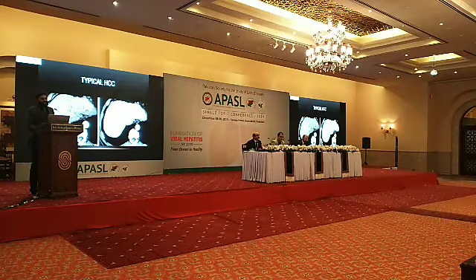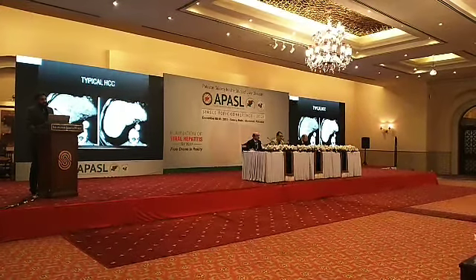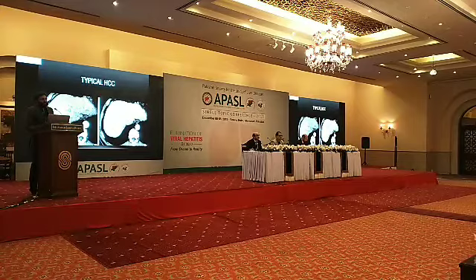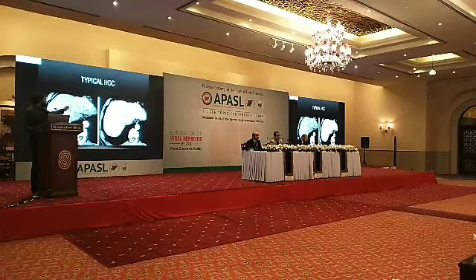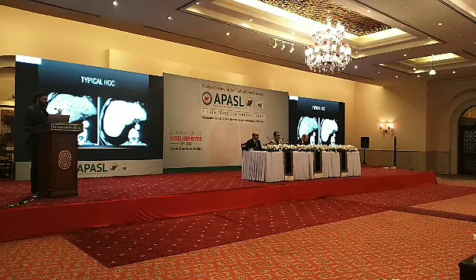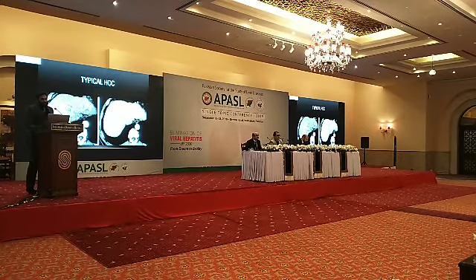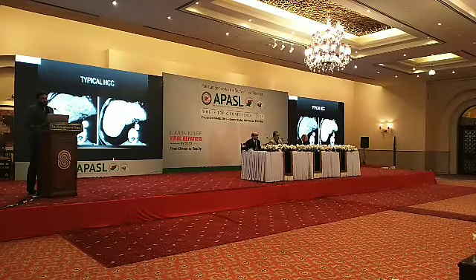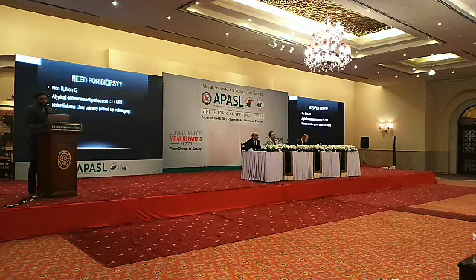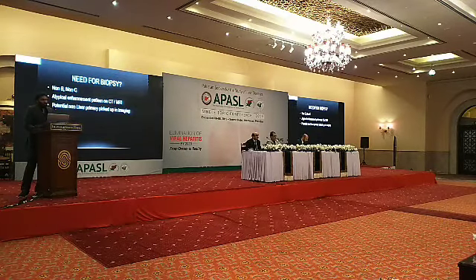So a typical HCC would be hypervascular, and it shows enhancement in the arterial phase, which is the image on the left, and you can see the lesion getting darker, which means that the contrast has moved out, and this is called washout in the portovenous and the delayed phases. A cirrhotic patient with this finding and with no other mass in the rest of the abdomen, you don't need any other test for confirmation of diagnosis.